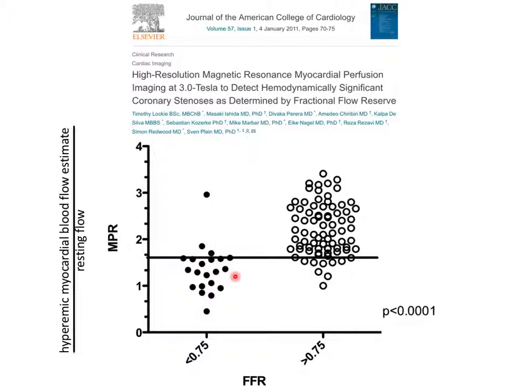To me, there's an issue with this data, right? I mean, whenever you read papers, you should read them with an open mind. Right? It's like, if a graduate student brought me this data, do I believe that data? Right? I mean, when you look at this data, does it look rational? Does that data look like that would happen? I don't know. This looks a little magic to me. It looks like half of a Gaussian. It just got cut off, right? I'm not really sure what happened here, but this does not look like a normal distribution in this direction, right?